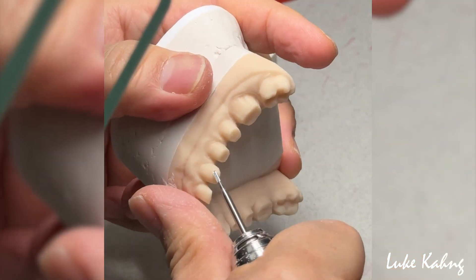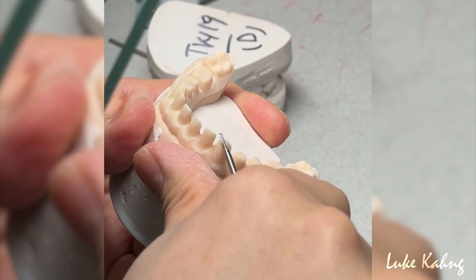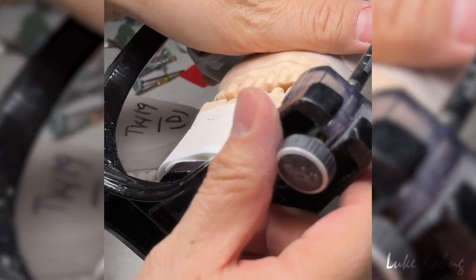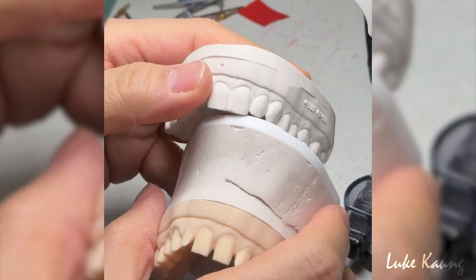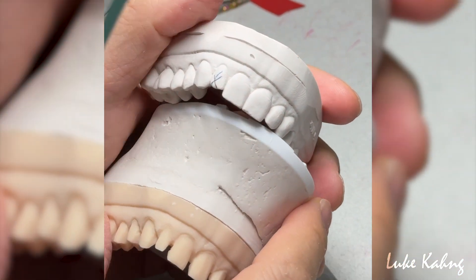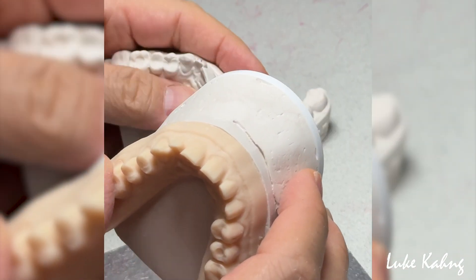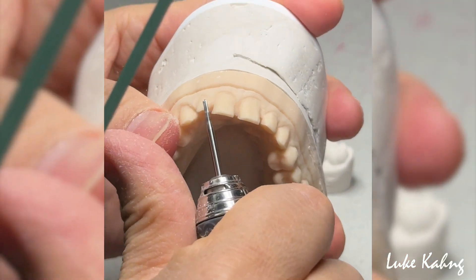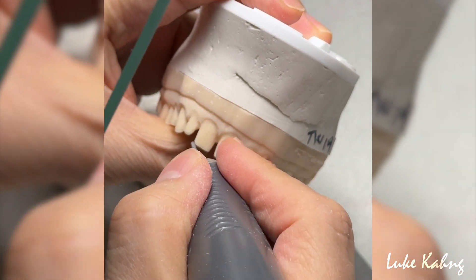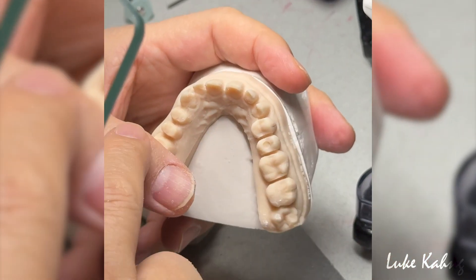Remember, this one is already prepped — now I just modify the second one, which is too tall. This is all veneer. The problem on top is the doctor will have a hard time, so I wish they can prep three to four millimeters, but sometimes that's tough. That's why I need the crown for this. I can decrease the incisal depending on the doctor — if they want more mamelons, I prep more; otherwise I stop. Good alignment.